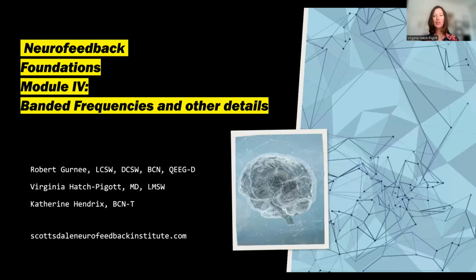So, electrode placement for an EEG. Electrodes are placed according to what is called the 10-20 system, an internationally recognized system of placing scalp electrodes so that data can be compared in a systematic way between clinicians for research and for clinical trials. There are other systems with differing amounts of electrodes, but this is the most common, and this is what we use for QEEG brain mapping.